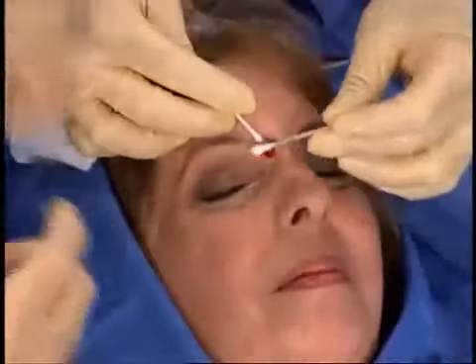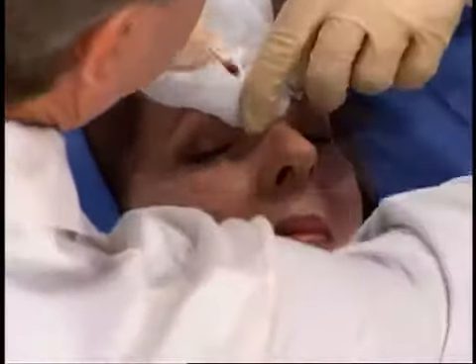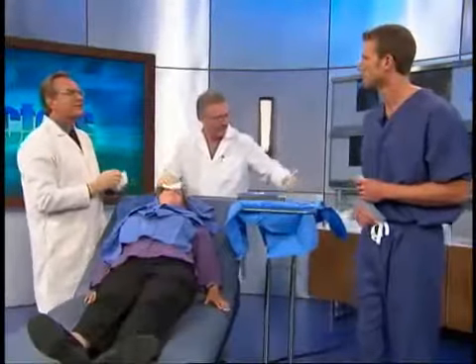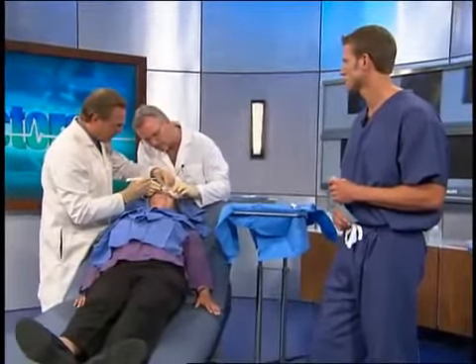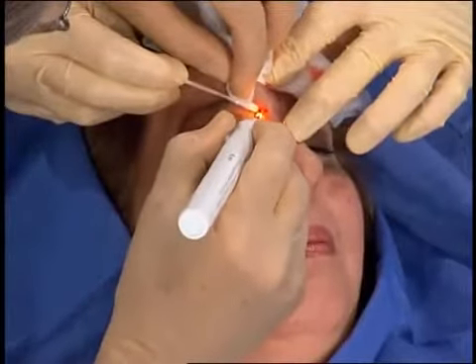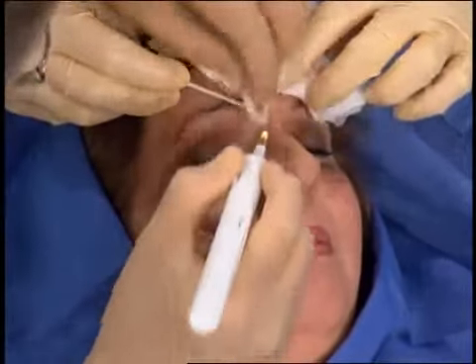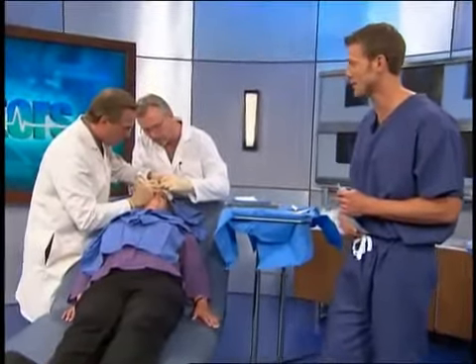This is a very sensitive area, so the whole planning of this incision is based on the natural lines of expression in her face. And, you know, as you can see, this is a little bit of what we would call a vascular area, meaning that there is a little bit of bleeding that we have to stop, correct? So we're going to do that right now for her. You may see a little bit of smoke. What Dr. Orden is doing is he's actually closing off blood vessels with the cautery device. Right. And that's the smoke you're seeing. Something that we use in medicine all the time.